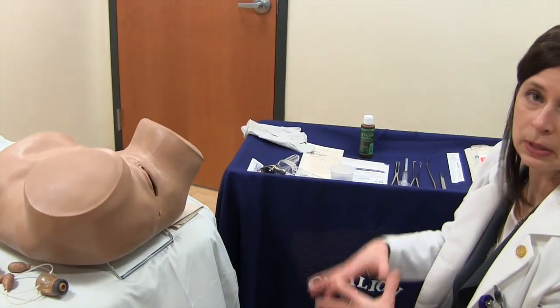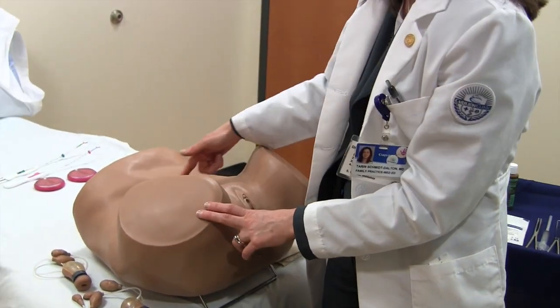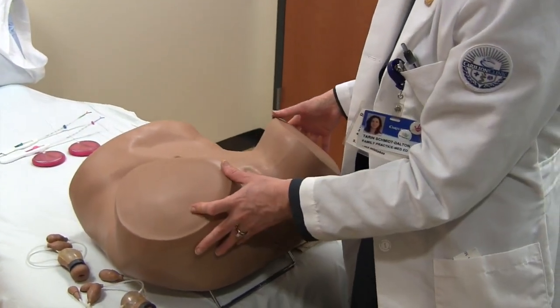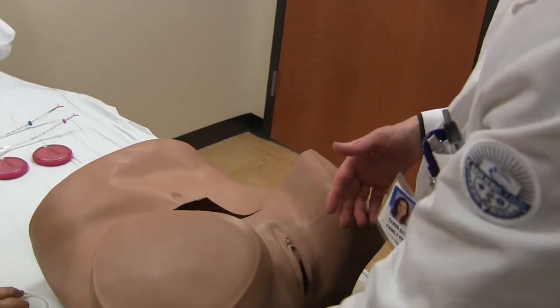This is an example of one type of setup that you could use when teaching the IUD insertion. This is a GYN simulator, a ZOE model, and we are set up in just any typical clinic exam room. This particular one has a window cut out of it in which the observers can go ahead and view the inside the uterus.